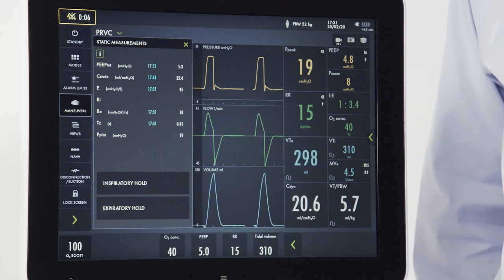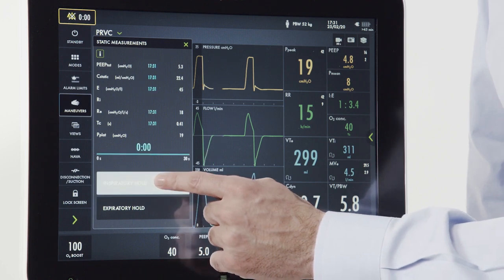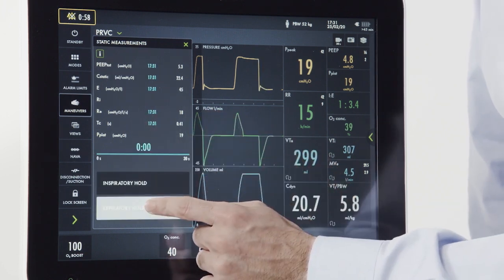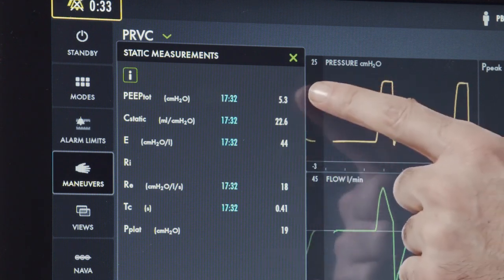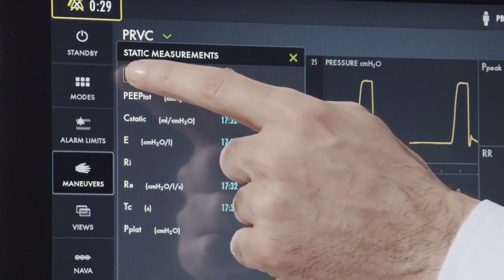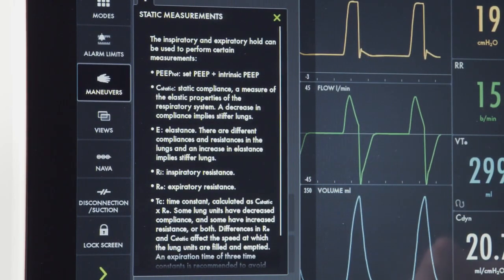To calculate our static measurements, we're going to utilize the inspiratory and expiratory hold buttons. First, we'll press the inspiratory hold, then we'll press the expiratory hold. Upon completion, we'll have our static measurements with a time stamp. We can also press the information button to get more information on the individual static measurements.